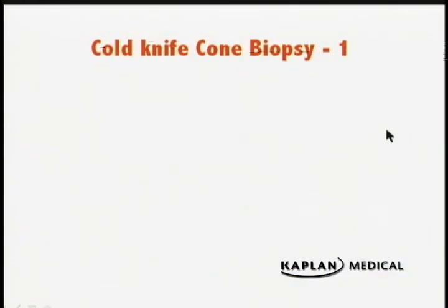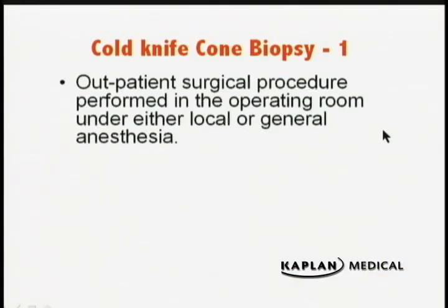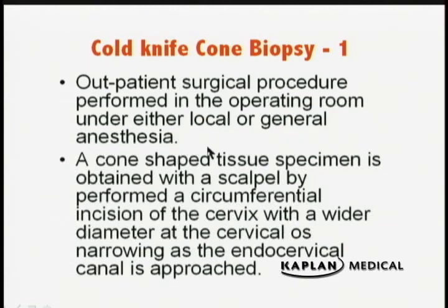Cone biopsy. The cone biopsy is also known as a cold knife cone biopsy because it uses a scalpel rather than a hot wire, which is the LEEP. This is an outpatient surgical procedure performed in the operating room. So it's not done in the office, under either local or general anesthesia. A cone-shaped tissue specimen is obtained with a scalpel.